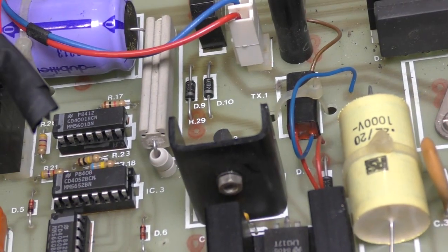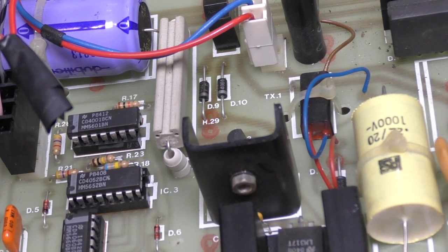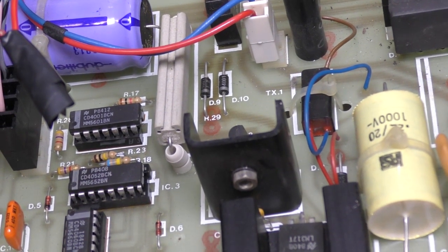That's the actual trigger transformer, that little square black thing. So that could easily be mounted up by the tube itself. That's the way that most flash applications do it.